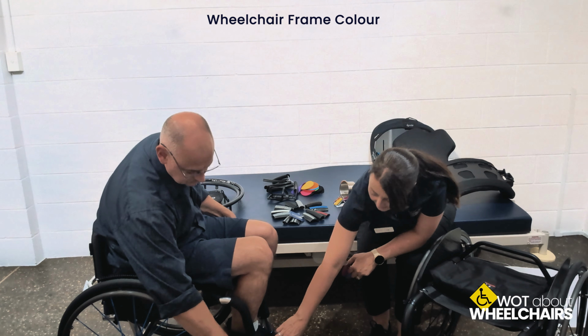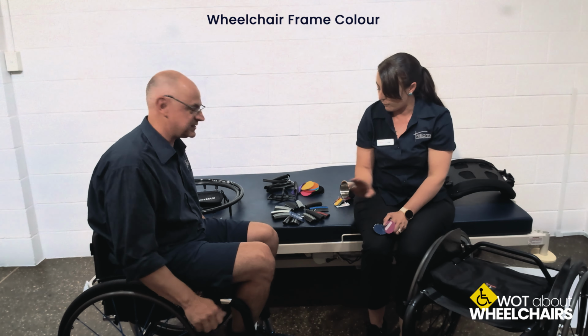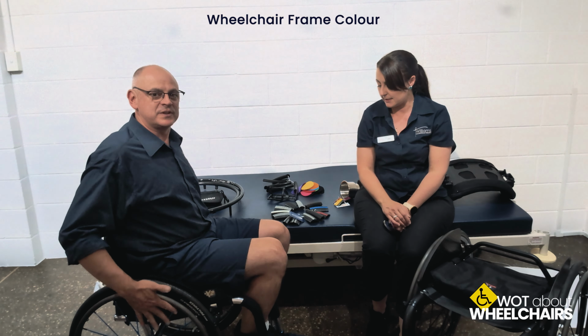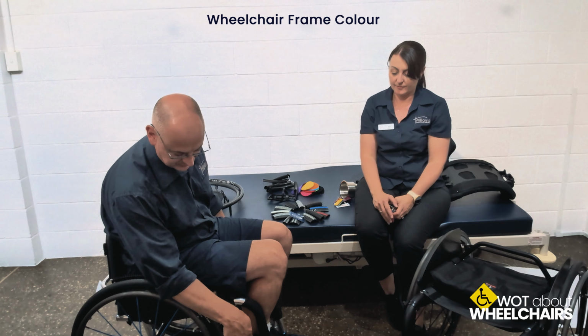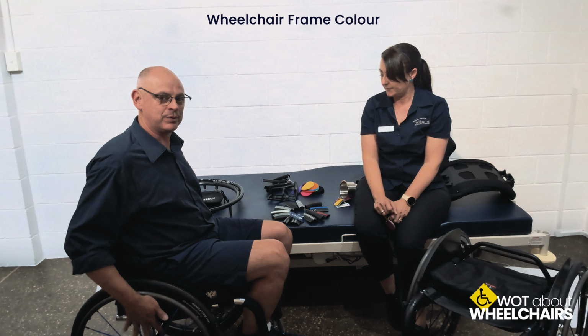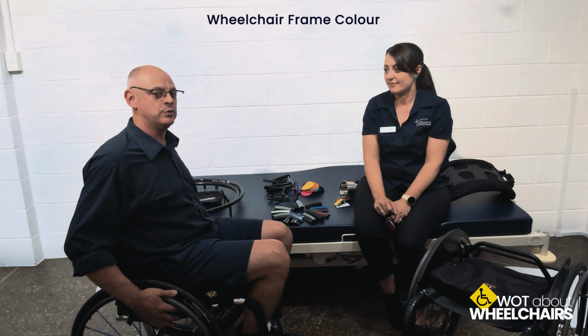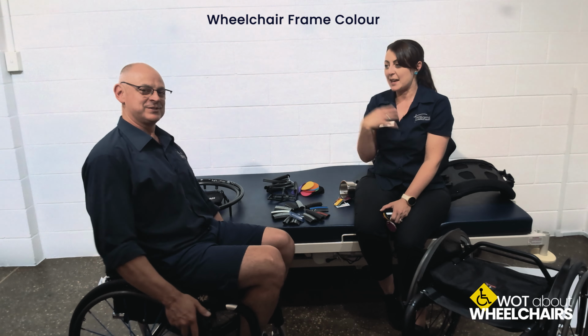Some people actually like to have just highlights of colour on the front casters. This wheelchair has little blue specks everywhere. Down at my front casters, there's a little blue component. It's also got blue spokes. A few little highlights. I like it, it suits me, and it's kind of like it matches our Williams O2 colours.